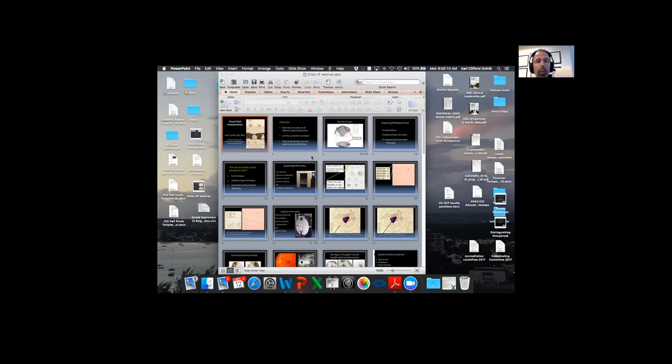When do you use stimulus 5 and 1? So stimulus size 5, I will use if I get a field and it just looks really bad, and yet the patient has some decent vision. I will use a size 5 because it's easier for the patient to see. So if someone's got a bad visual field defect, but you want to follow that field defect for change, if you do a size 3 and it's black, you can't follow that unless, of course, there's a miraculous recovery. So in someone who has an optic neuropathy and their size 3 field is black, I'll get a size 5 because I may be able to follow that better for change.